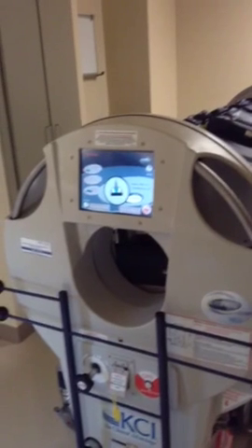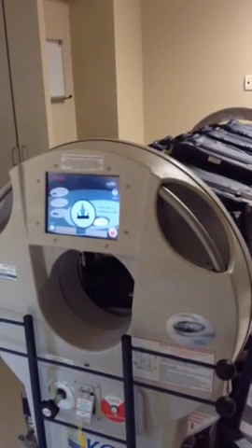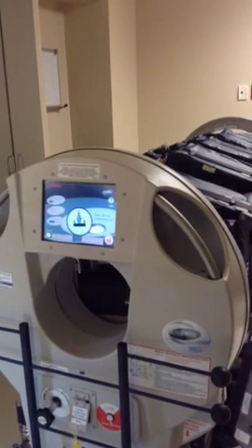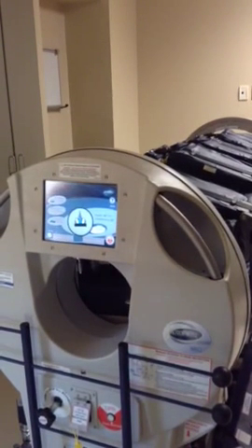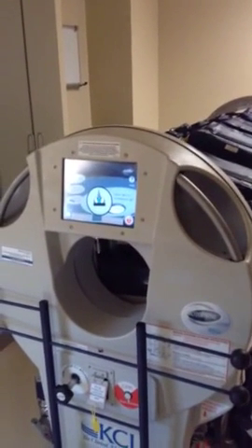So manually, if you can't get it to go, pull it, turn them over. Just look where the vent is and know that that's probably the direction that you went in. But a lot of times you forget to do that. So the risk of doing that is pulling the lines out anyway. But then you're in big trouble.